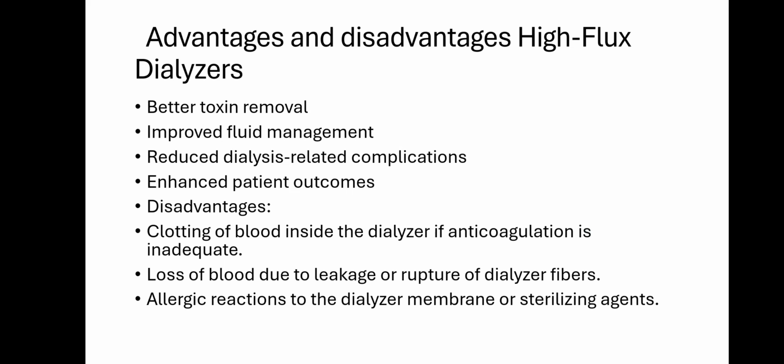Then the advantages and disadvantages of high flux dialyzers. High flux dialyzers mean better toxin removal, and they improve fluid management, reduce dialysis-related complications, and enhance patient outcomes.